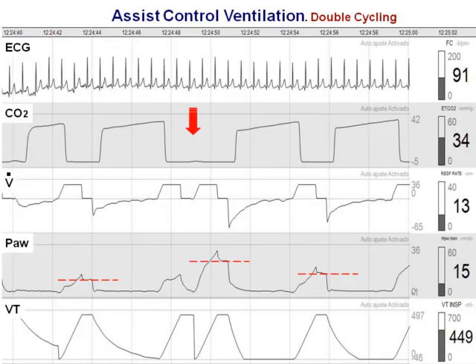And this is an example of the double trigger in a patient. This is EKG, this is CO2, flow, airway pressure, and look at the CO2. In that case, there is no expiration. Here, there is a double trigger. This is double tidal volume, and in the next breath, you will see the lung is exposed not only to overdistension, but also, in that case, to more volume.